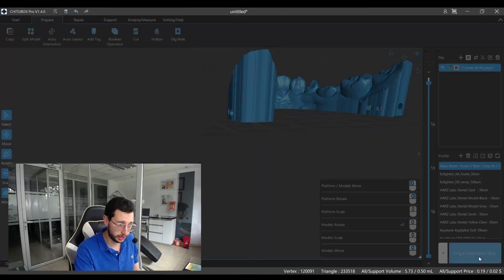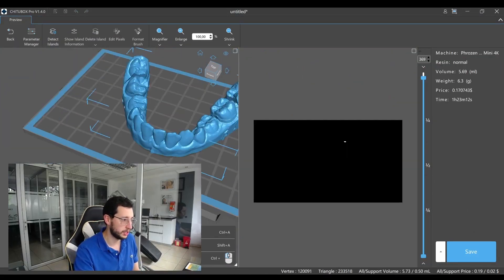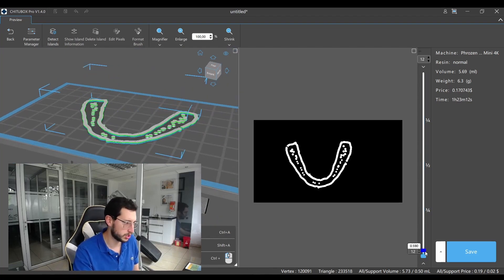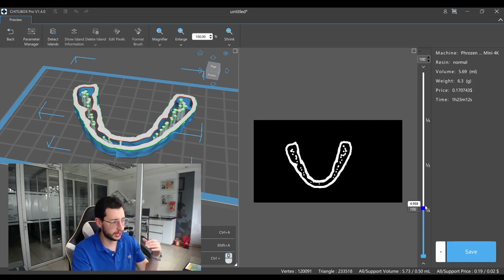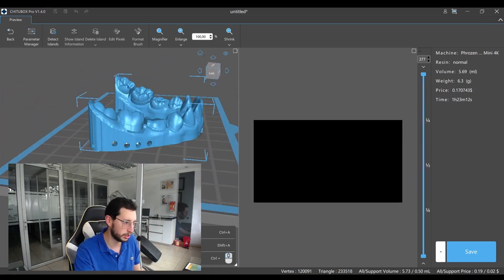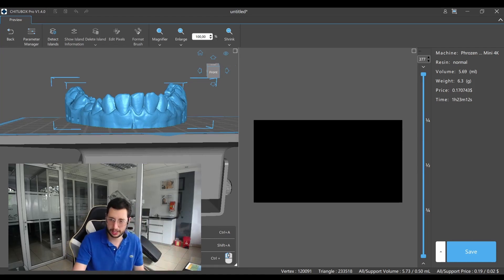So basically with this, we are done. I can proceed to slice with a single parameter, and this model will print beautifully — it will start from a flat part and that piece will hold everything together. The supports will prevent any problems at the cusp tips, and the drain holes will prevent any deformations and resin getting captured inside. That's it — it's that simple. Now I can save and send it back to my printer.